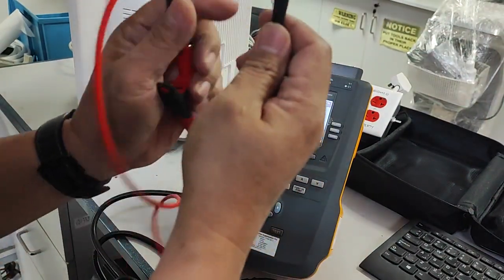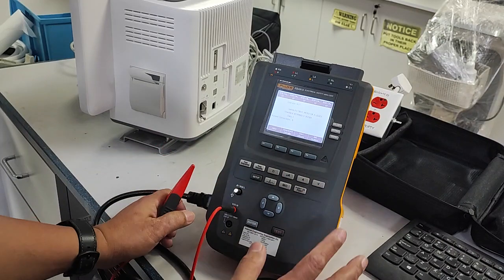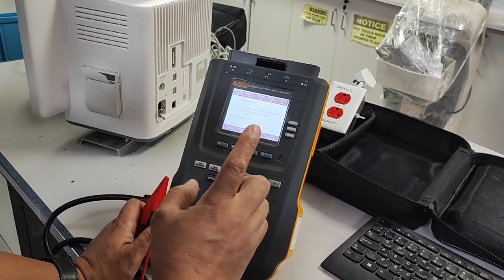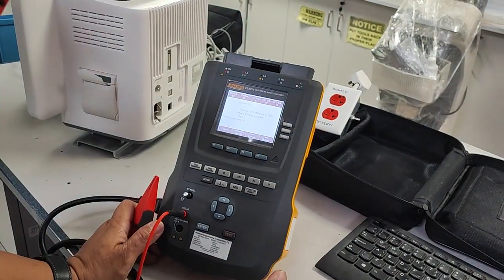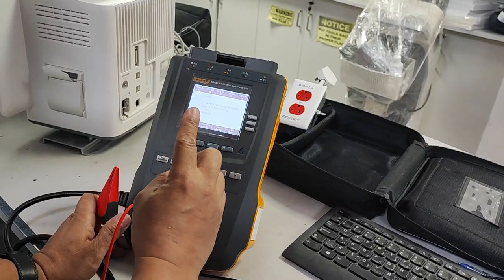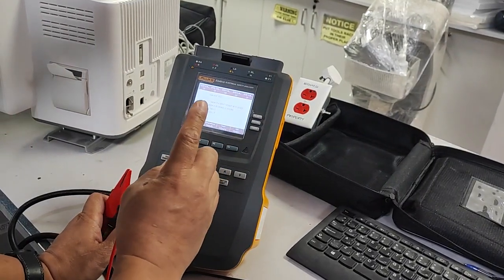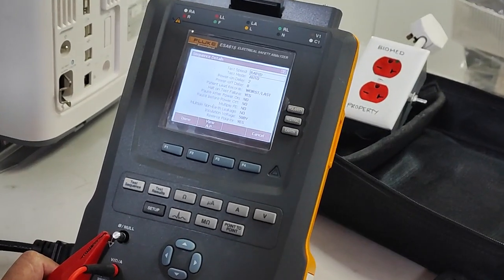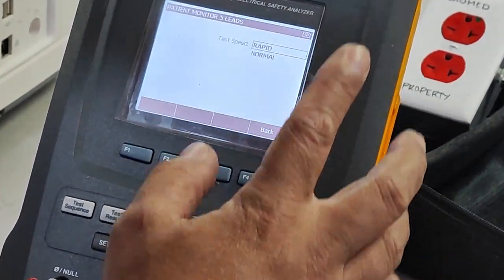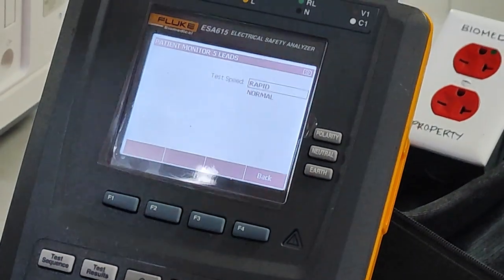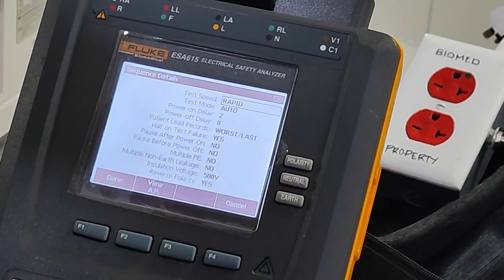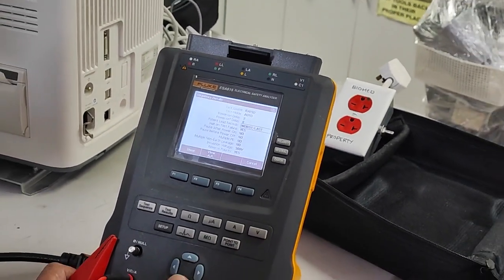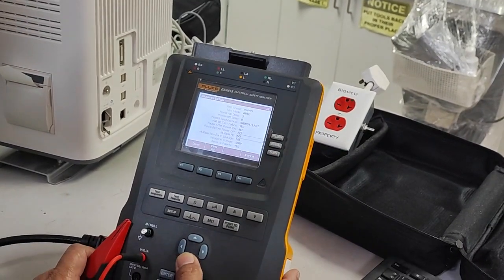We connect red to red for grounding. Before that, select the test sequence — there are two types: rapid test and normal test. Normal test takes 20 minutes; rapid test takes only 11 minutes. Just check the sequence and press Enter to select normal or rapid. We are using rapid so it will finish faster. Power-on delay is two seconds. All parameters are okay.